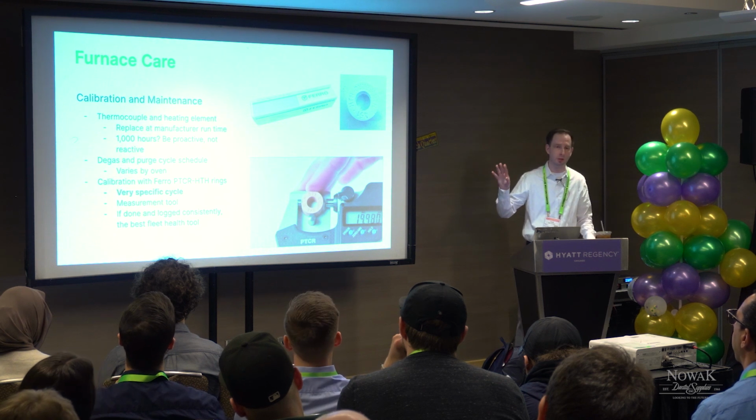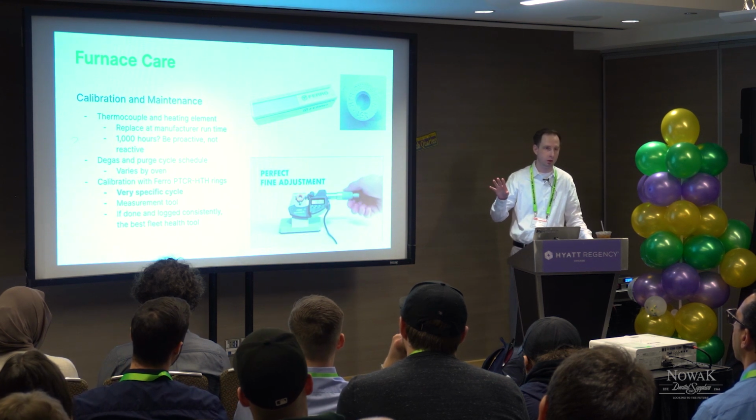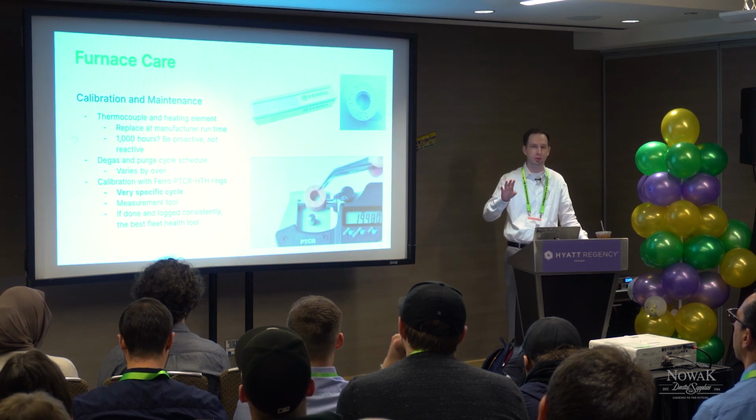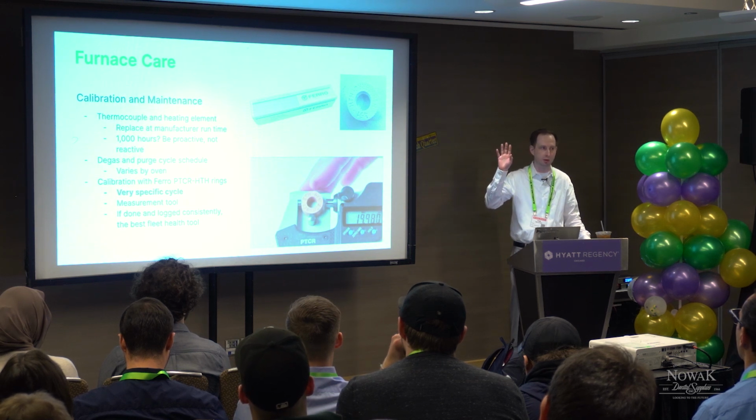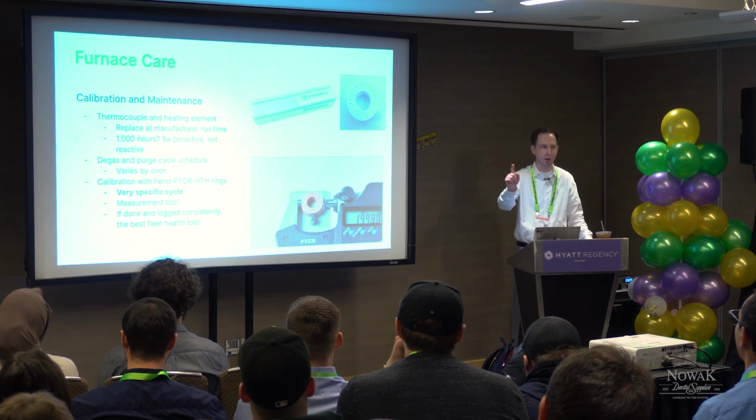Thermocouples and heating elements in furnaces have a life. Do you all know what your number of hours for your thermocouples or heating elements are in your furnaces? No, he's my engineer.